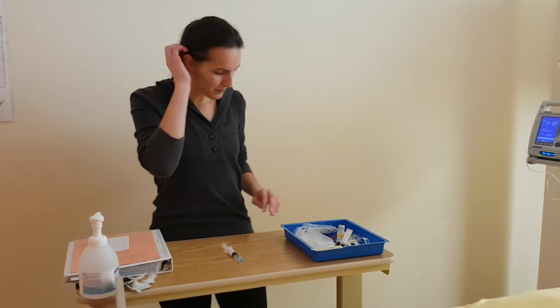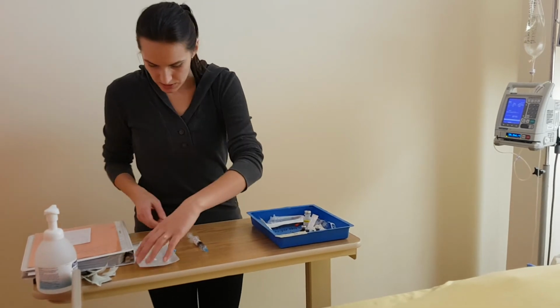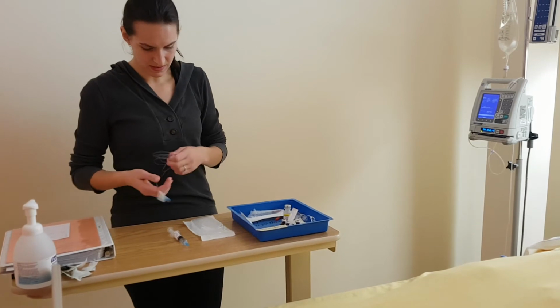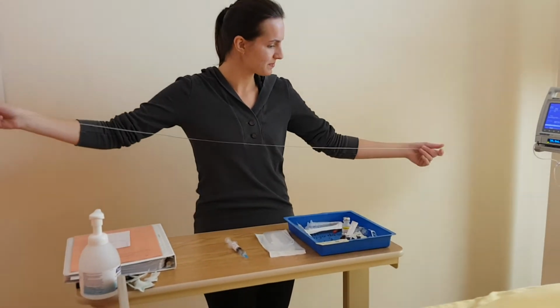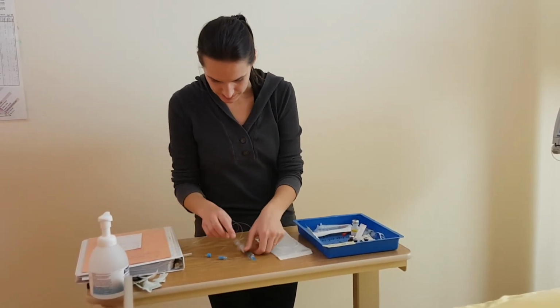So I'm going to begin by preparing my medication. Right now, 40 milligrams, 4 ml, which is in my syringe. I have my tubing here, my micro tubing. The right route is IV, this is given IV, and the right time is daily, or 0900.